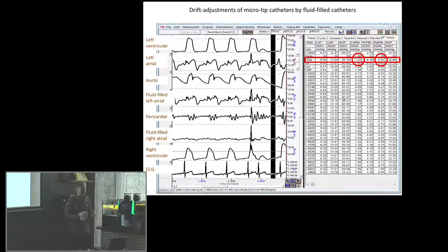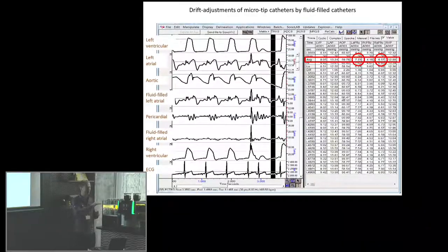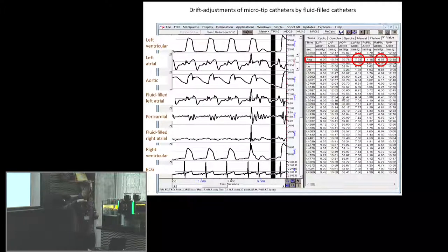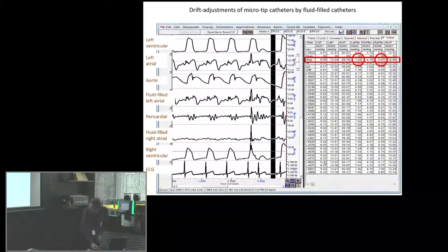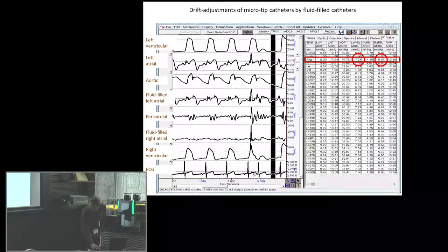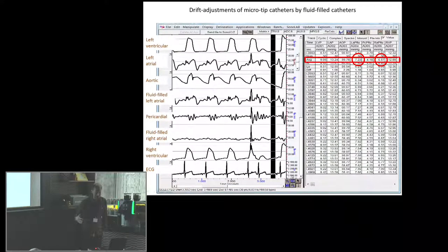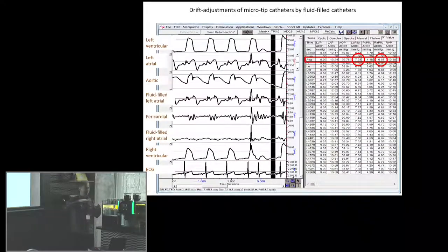So we use periods where there's no change in pressure during the heart cycle. It's flat, so we don't have these problems with oscillations and artifacts. In our recordings, we introduce an extra systolic beat. And what happens then is that we have a very, very long diastasis period in the following diastole. So that's where the pressure is flat.